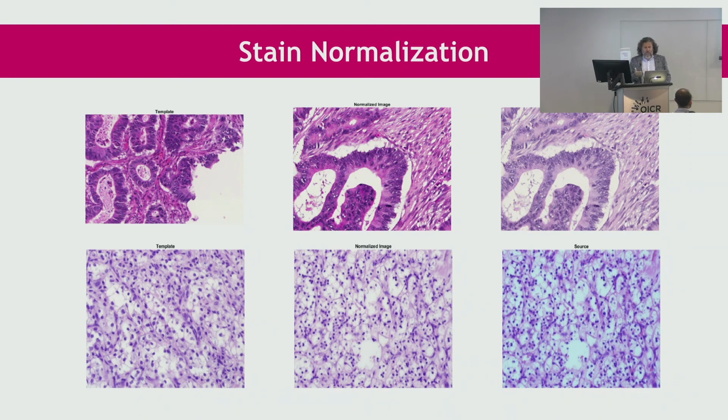And then the second one is you say, okay, the last one is the source. You say the first one on the left is the one that you say it should be like this. The last one on the right, the last column, should be the images that you get. And the middle one is the one that you adjust. So you normalize it to become what you want, or you normalize it to a certain level. So you can create consistency.